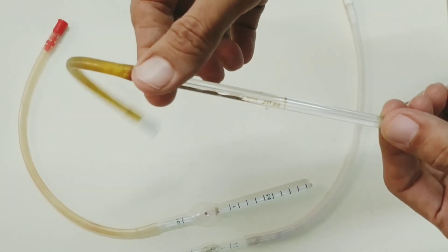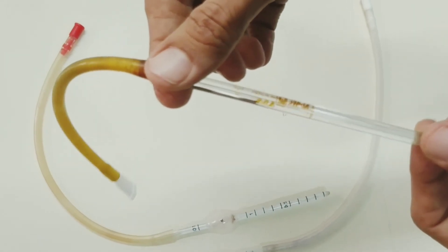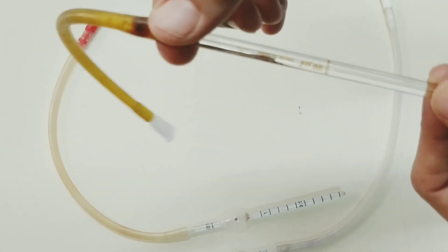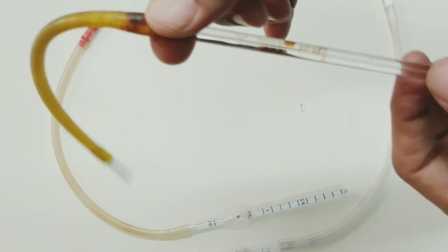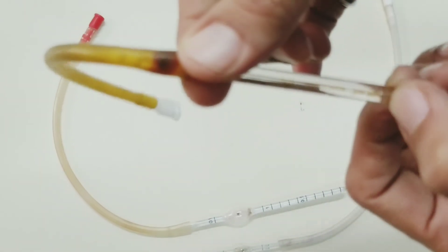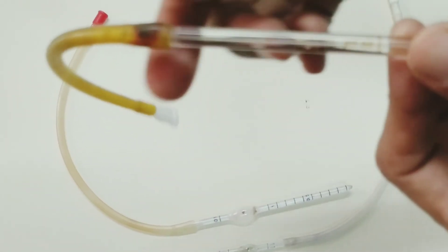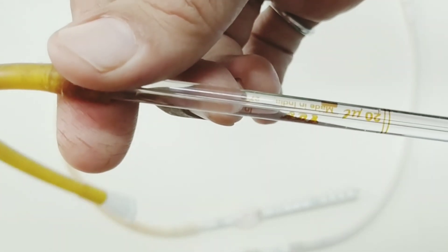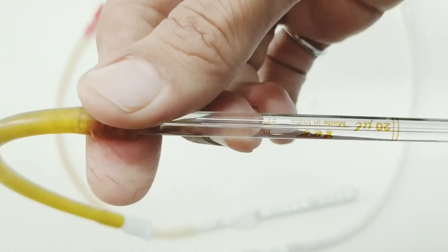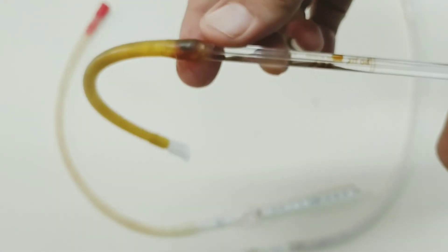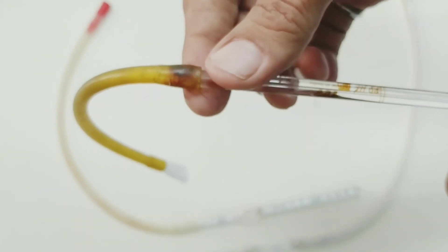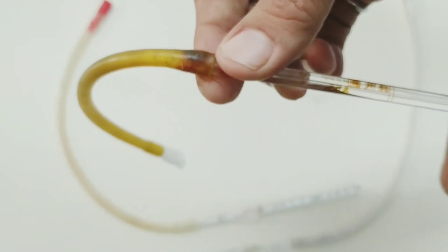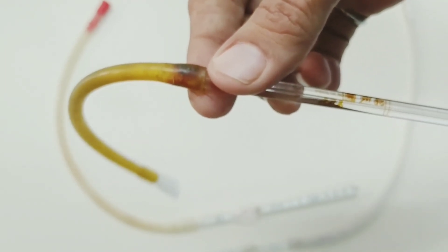The hemoglobin pipette has no bead, it has only a stem part, and the marking is only a single marking of 20 microliters. This is 20 microliters in the hemoglobin pipette and it is used to get the blood for hemoglobin estimation.